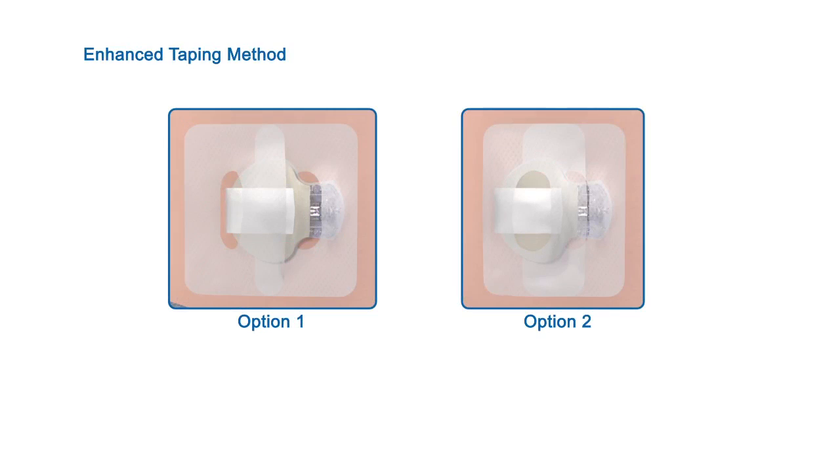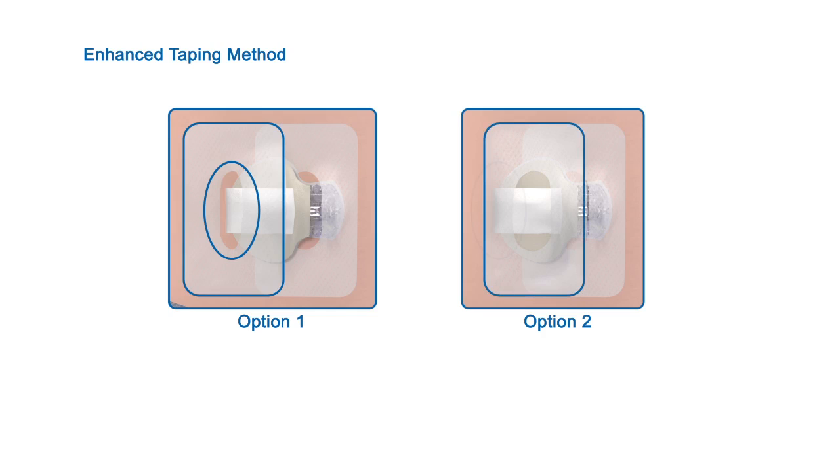There are two options for applying this extra overtape. Option 1 leaves the back of the transmitter open to allow for better ventilation. Option 2 covers the back of the transmitter to help reduce the chances of the transmitter catching on your clothing.